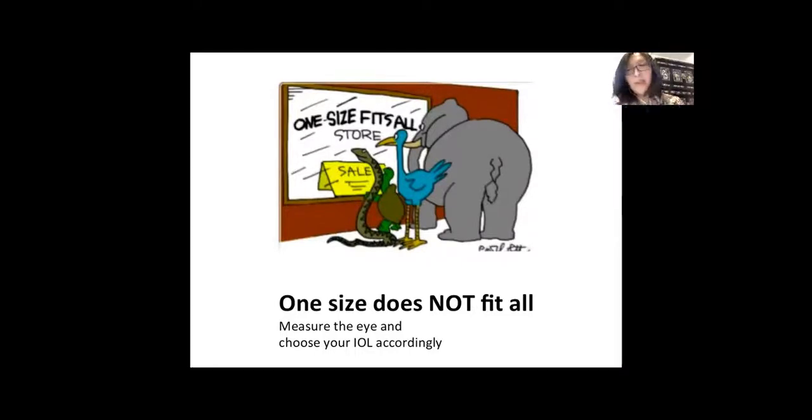One of the things that we don't have time to talk about is my choice in the absence of a premium IOL, which is to perform a lot of what I call monovision, and that is putting the implant into the dominant eye aimed at plano, and then going for a little mild myopia in the non-dominant eye. And mild myopia, I would say I would go to about a -1, or in a patient who has had the experience of monovision previously, I will go up to a 2 diopter difference in the non-dominant eye if a patient is able to tolerate that.